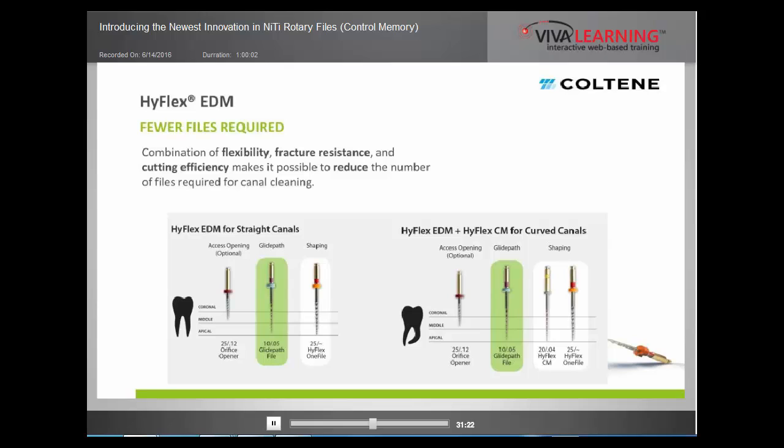As a clinician, as an endodontist, I have never had to resort to this, just so you know. If this guy does not want to go to working length, we stop short, let's say 2-3 millimeters. I've shaped to here. I will finish with control memory files just to finish the apical 1/3. So orifice opener, 1 file, and if it's not going and it's not advancing, we finish with control memory files. Let's say 25.04, 30.04, 35.04, whatever you wish to finish your case to.